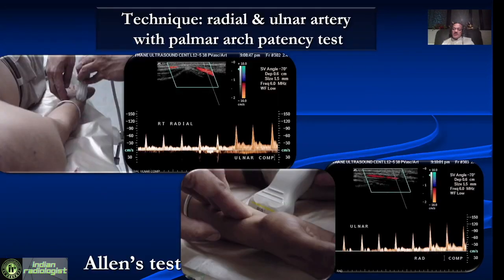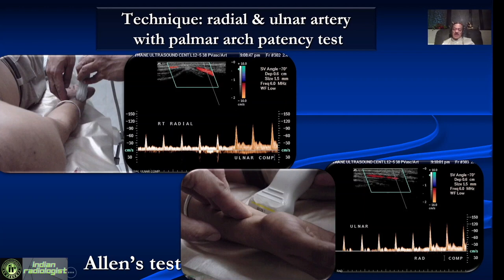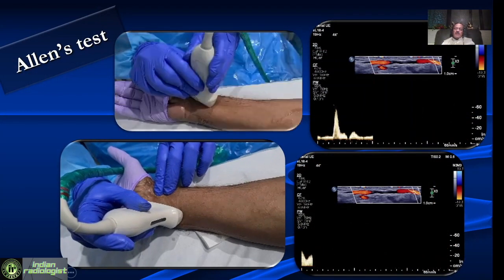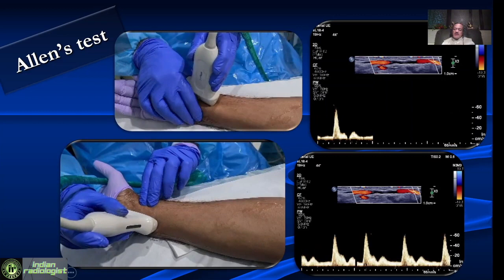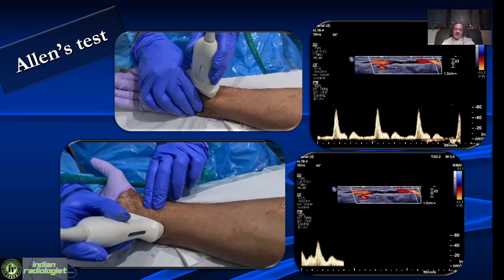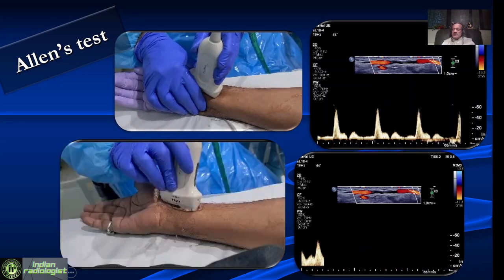There are some tests we need to do in the upper limb. One is the ulnar stress test, also known as the Allen test, done to look at palmar arch patency — to find out if the palmar arch is patent before we take the radial artery for bypass surgery. We look at the radial artery, compress the ulnar, and look for an increase in velocity. Then we look at the ulnar, compress the radial, and again look for an increase in velocity. This increase in velocity typically should be at least 30 to 40 cm per second.